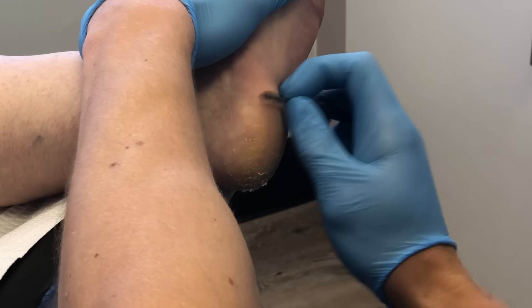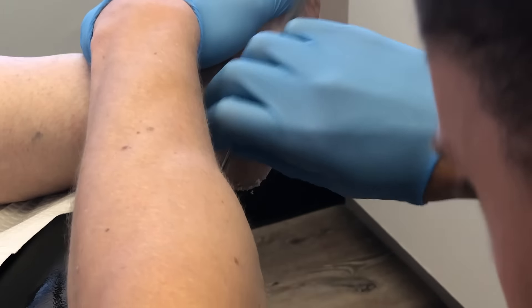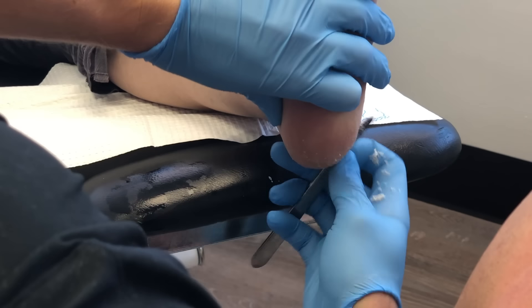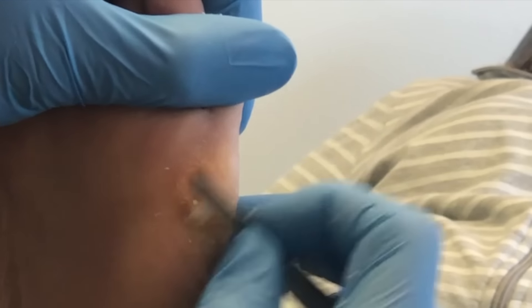We've moved to the heel to remove some of the callusing around the heel. Again, you'll notice with the left hand we're trying to pull the skin back to provide some skin tension. This commonly happens during winter months but can also occur during summer months. Some people are also more predisposed to having callus formations, as you can see on this patient.